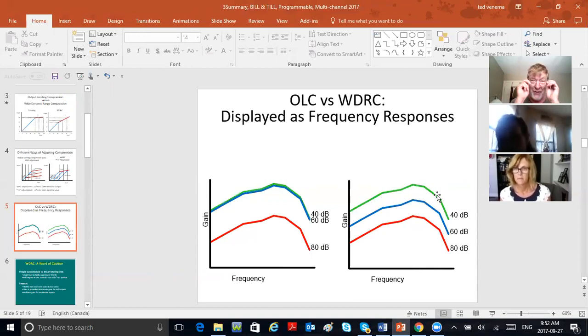So what's interesting, and what we will learn in a couple of weeks from now, actually probably as early as next week, is that digital hearing aids have a solution for this. They actually resort back to linear gain for average inputs. It's a strange looking function, and I could show it to you just to bug you, just like I did last week. And then it'll be WDRC, and then linear gain, and then output limiting. Check this out, just to bug you. I'll stop sharing. Here we go.